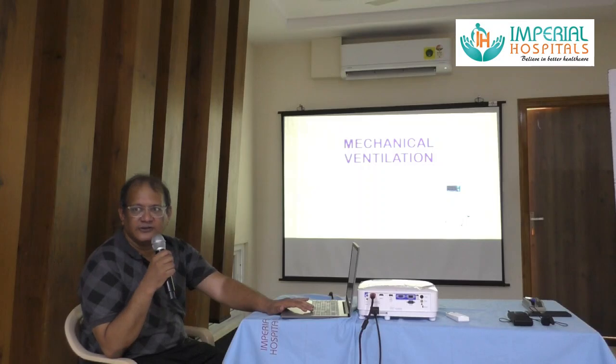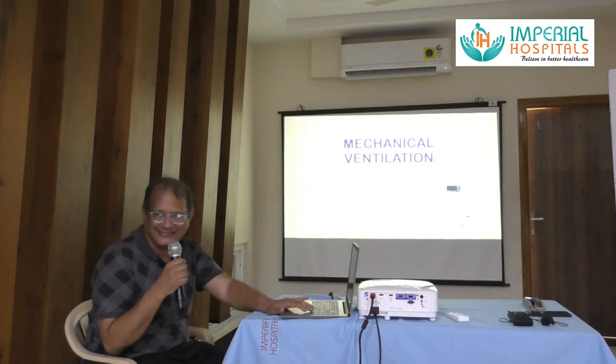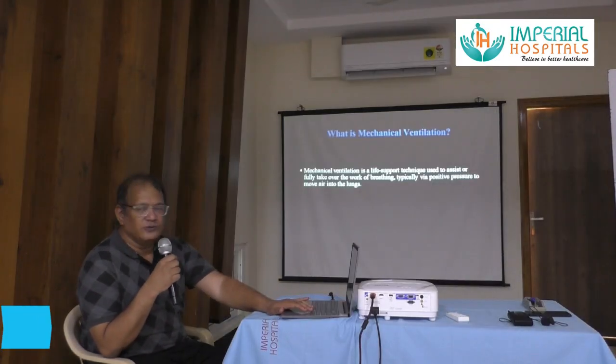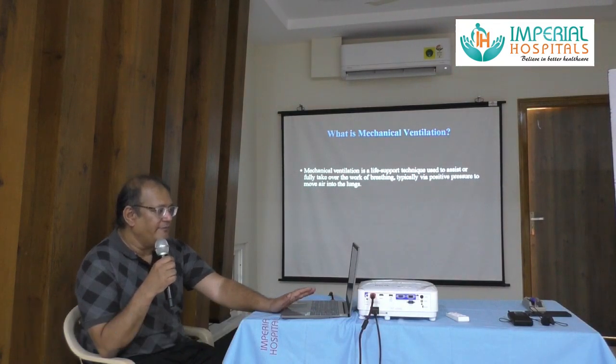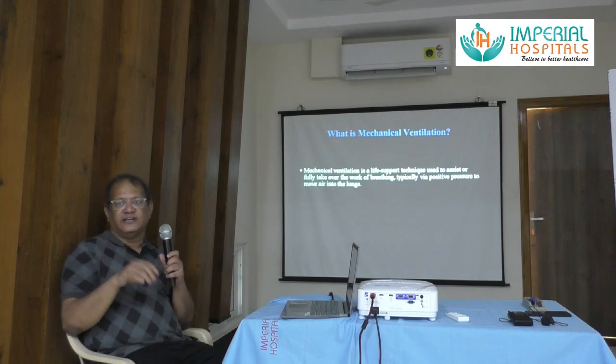Good afternoon, everyone. Today's topic is mechanical ventilation, the basics. So what is mechanical ventilation? Mechanical ventilation is a life support technique used to assist or fully take over the breathing or work of breathing from the patient. Typically, positive pressure ventilation, which moves the air into the lungs.